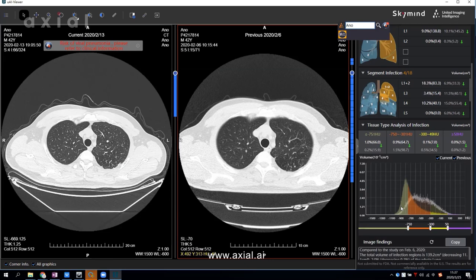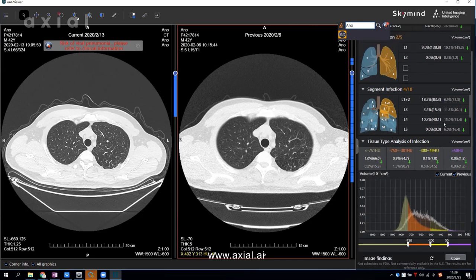Besides using Axial AI to diagnose and analyze coronavirus, you can also use it for research. Using the precise values analyzed by Axial AI, you can understand the effectiveness of different types of treatments.